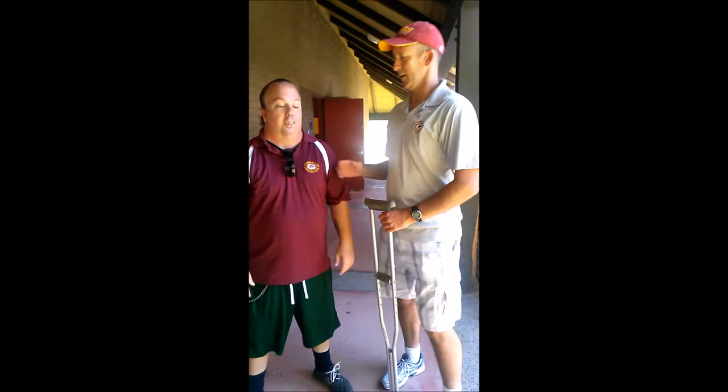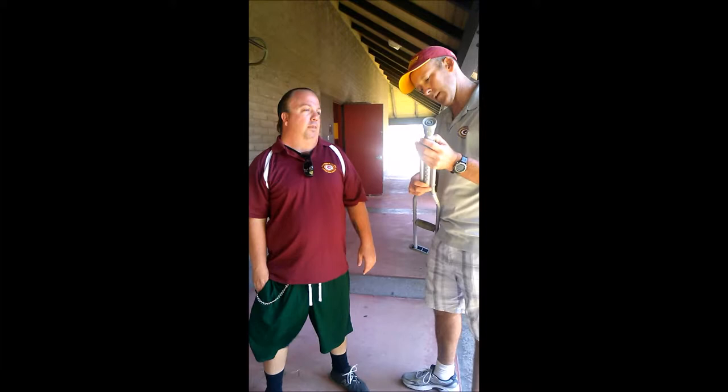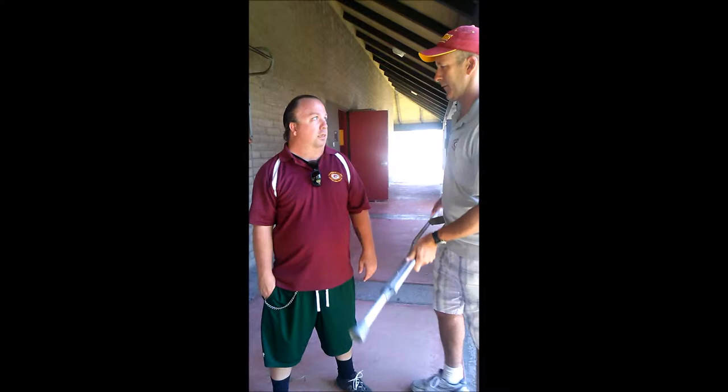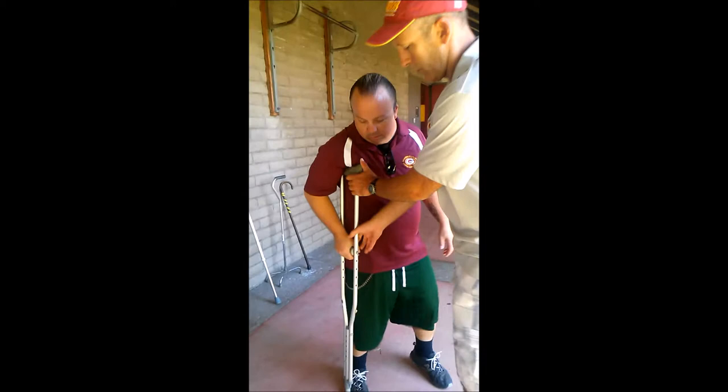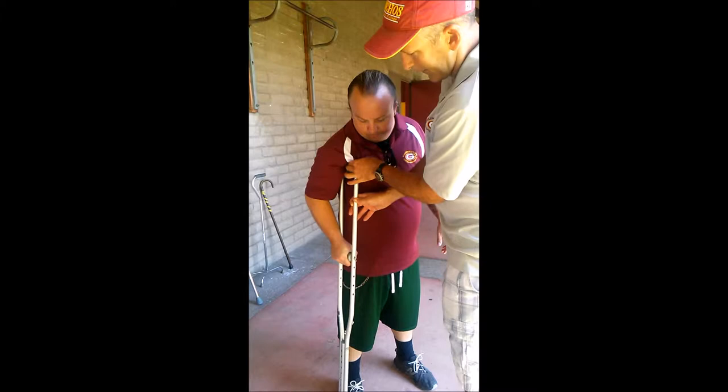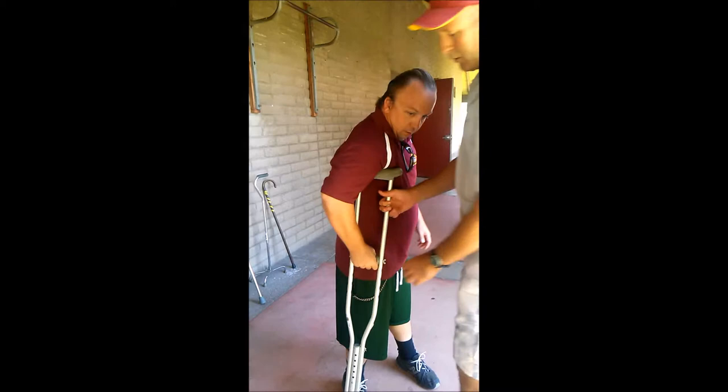Now we've got Coach Johnny. John, how tall are you? Five six and three quarters - we're going to round you up. Who are the biggest liars in the world? Guys that are five foot eleven. Okay, this actually ends up being a little bit high. Go ahead and hold on to that, keep your feet where they are, go six inches out and forward. I think we were a little bit high here and got too much of an elbow bend.